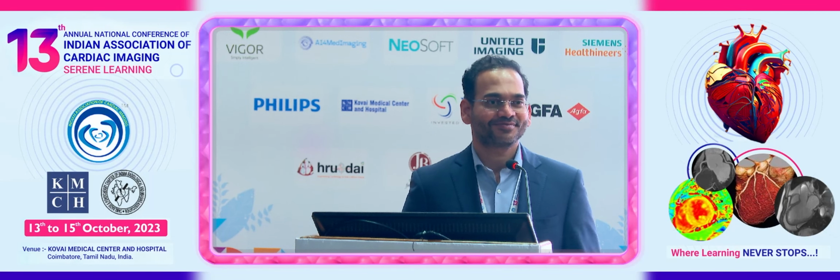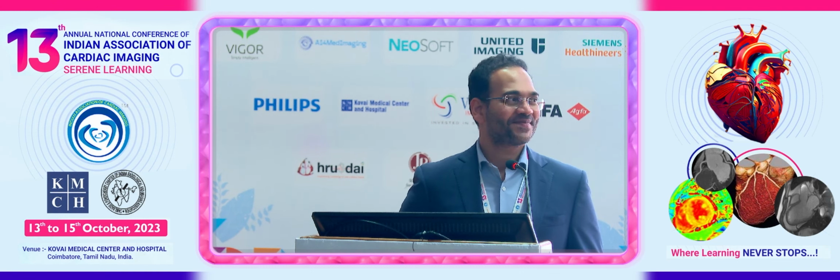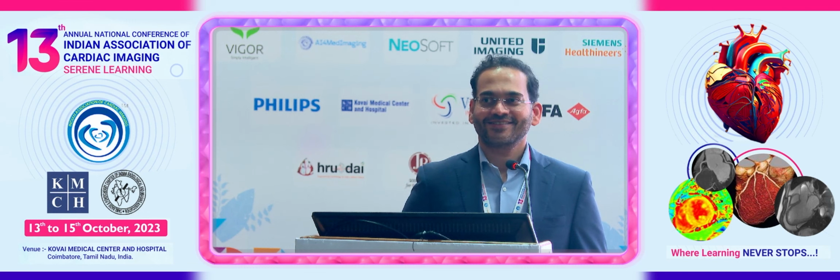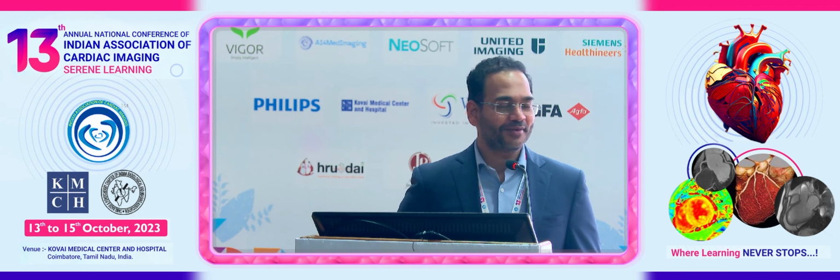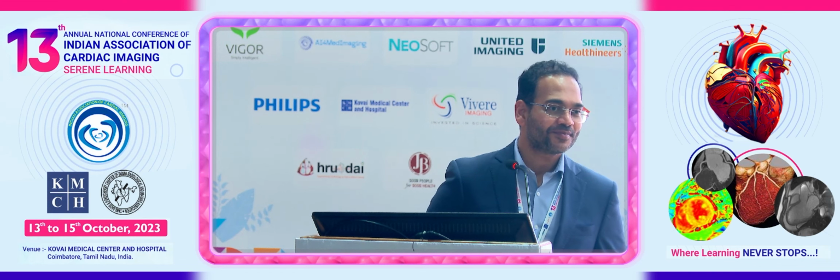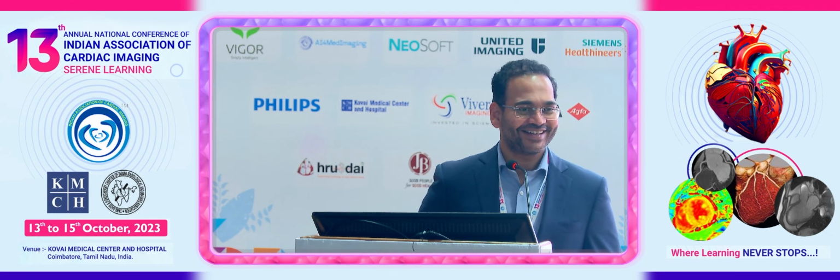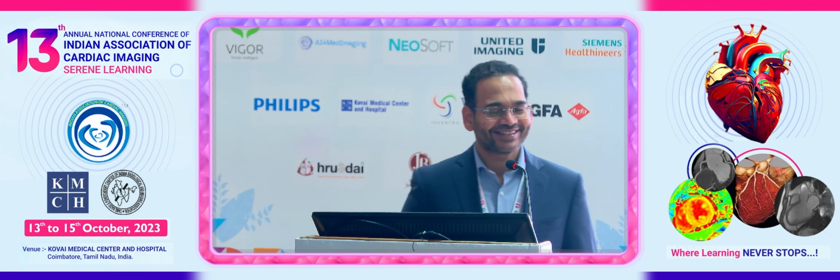So are there any questions from the audience? And if Vineet is around, we can actually do Ritu's question because we really have time. So, and thank you for that. No problem. No, he's not here. Sorry? No. So, I mean, I think we can talk about high-risk plaque a little more.